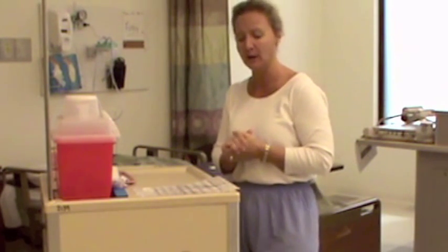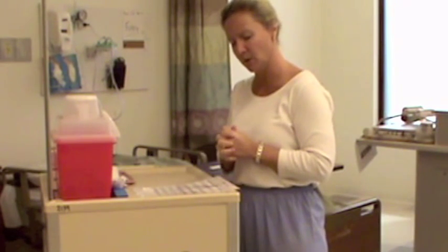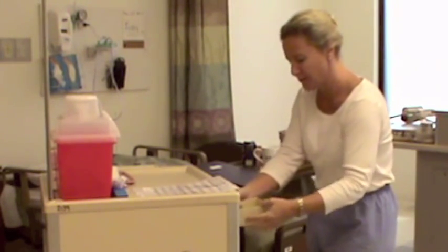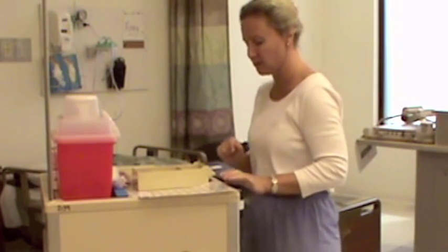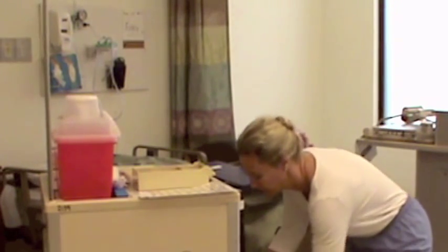And then probably a 3 milliliter syringe, unless I'm giving up to a volume of 4 mils, then I might need 5. But I'll look at my medication and see the amount that is going to be required to be injected. So I'm going to take Mr. Hoshi's med box, and I can see already the Tygan is 200 milligrams per 1 ml, so I'm going to use a 3 milliliter syringe. So I'm going to find my equipment.